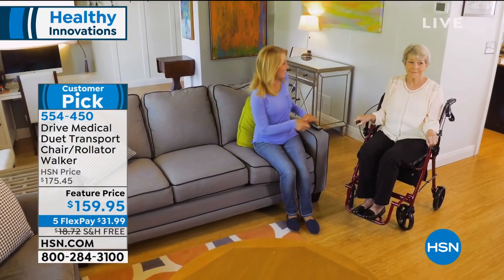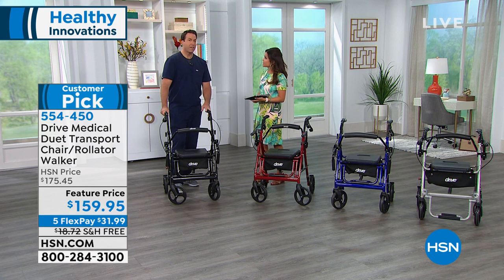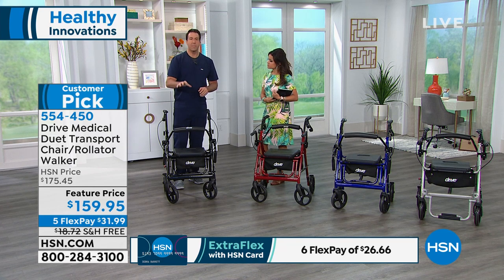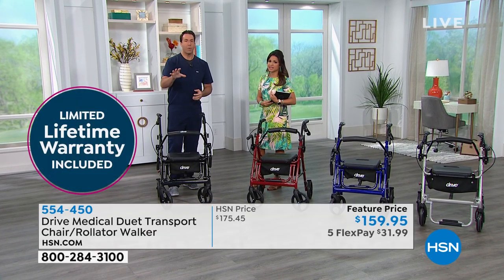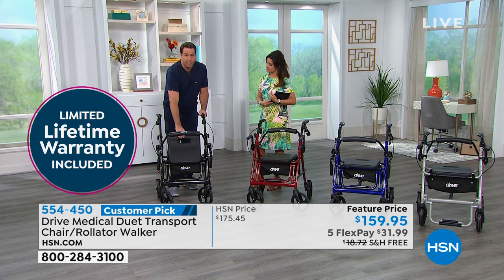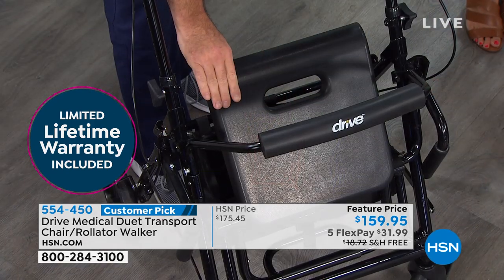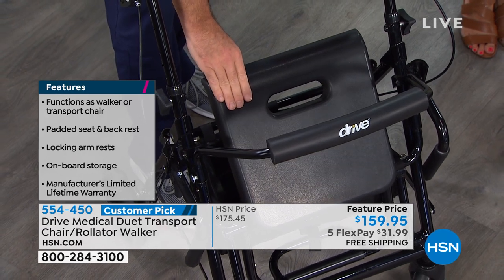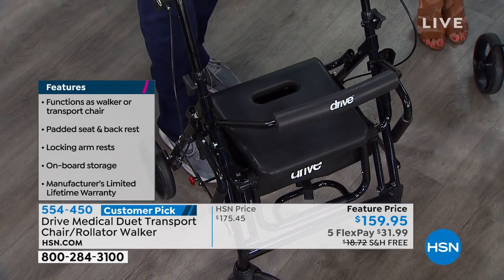You can't just go with any brand that doesn't have Drive Medical's quality. Quality is everything — you won't find a lifetime limited warranty on any of these competitors. I shop these all the time and you'd spend $100 to $150 more than what HSN brings you the Duet for. The seat is a non-rip seat giving you about 19 inches of width, so it won't weatherize over time like a current rolling walker. This ingenious aluminum design supports up to 300 pounds, with ergonomic hand rests.